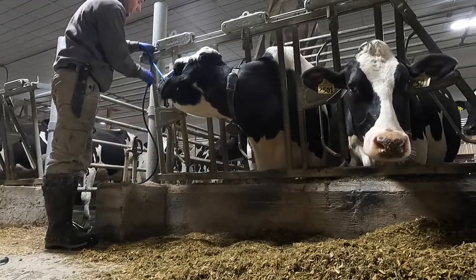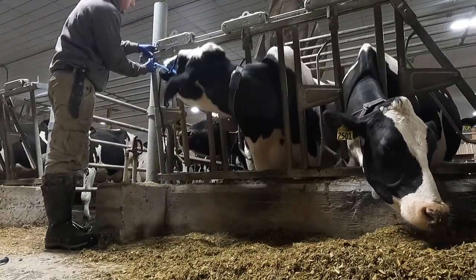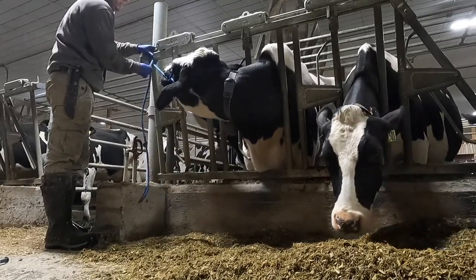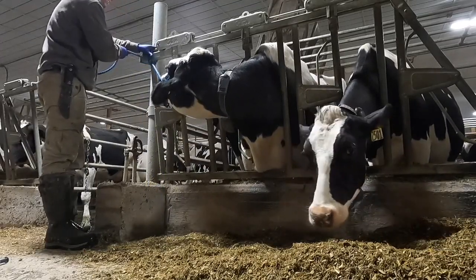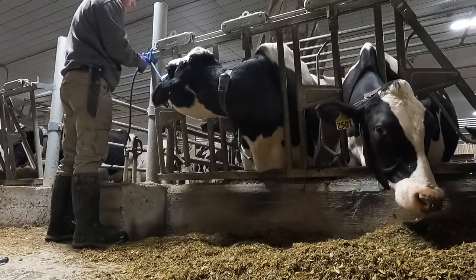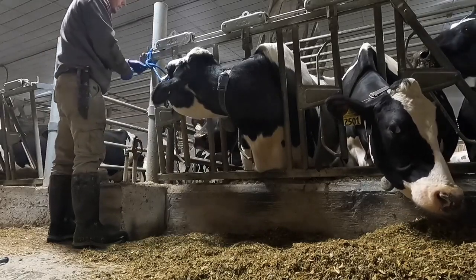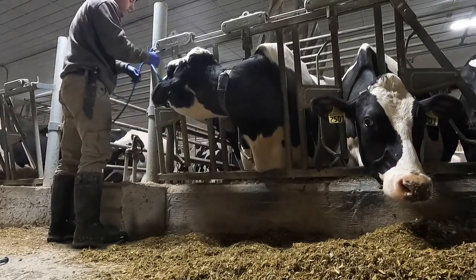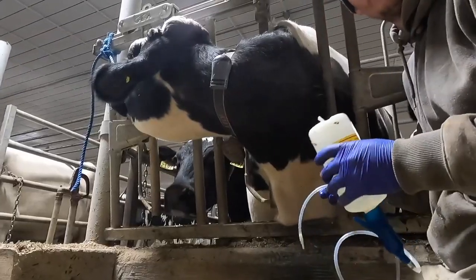I try to get her restrained as tight as I can, because if she starts moving around when I'm trying to put the bottle of dextrose in the vein, it's going to push the needle and fall out. It's got to go in the vein or it's not going to do anything. Let's see if I can get it on the first try.